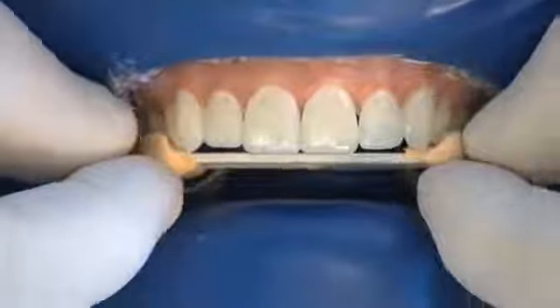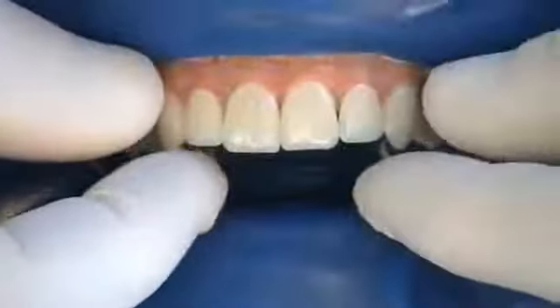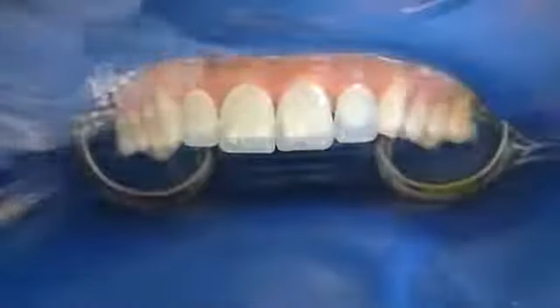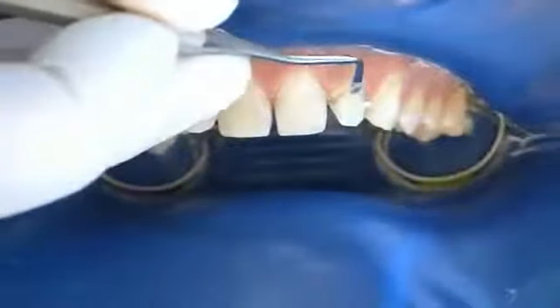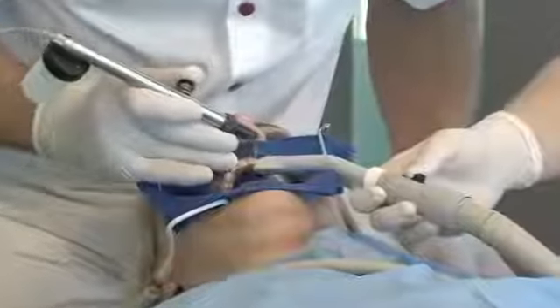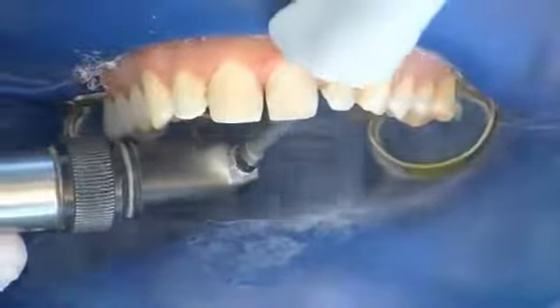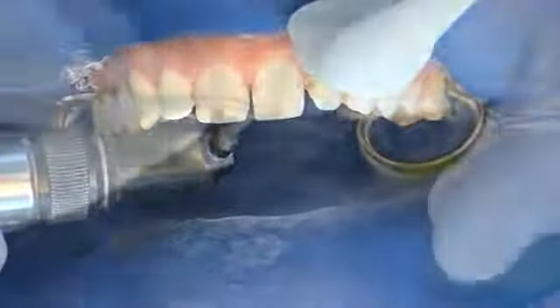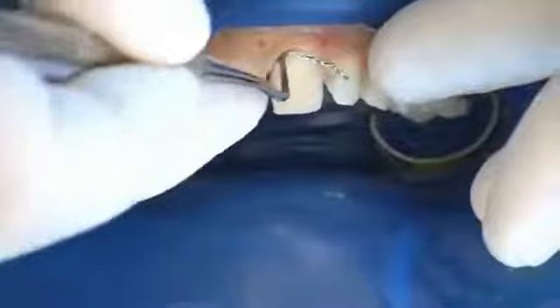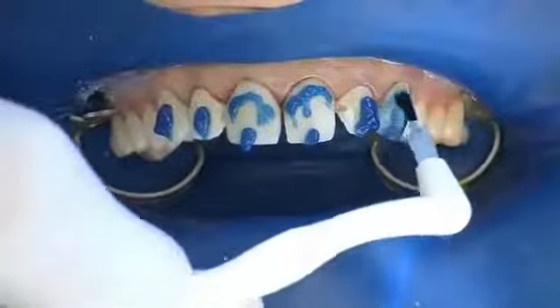This makes it possible to check the future occlusal plane. After removal of the Componeers, the teeth are cleaned and preferably sandblasted to ensure subsequent optimum conditioning. A retraction cord can optionally be placed for improved cervical control. The etching gel is applied to the teeth and distributed to all surfaces using a brush.